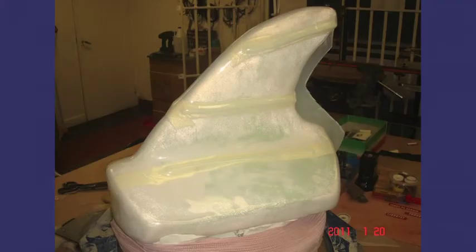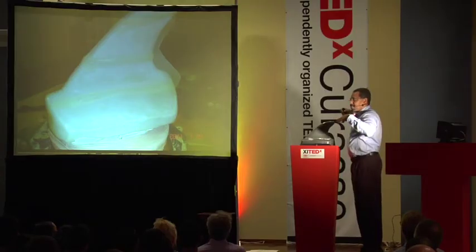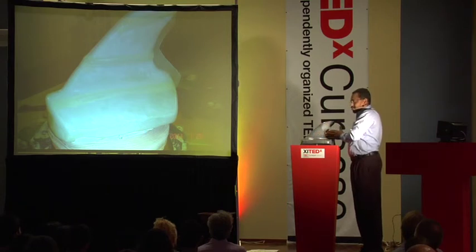And this is the rough device that we made. Actually, we did it with bubble forming. That is, you have a plastic plate, you heat it up, and then you pull the shape with vacuum over your mold. This was the mold. But then, how do you get thickness in the front and flexibility to the back? Well, we had to manipulate it, and you had only seconds to do that before the material would cool. Pulling it all back, manipulating it, we could get exactly that: a strong area in the front and very flexible to the end, so the animal could tense the back part as a sail to move and curve as it was using the device.